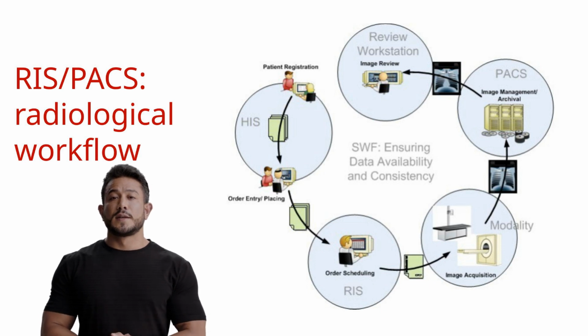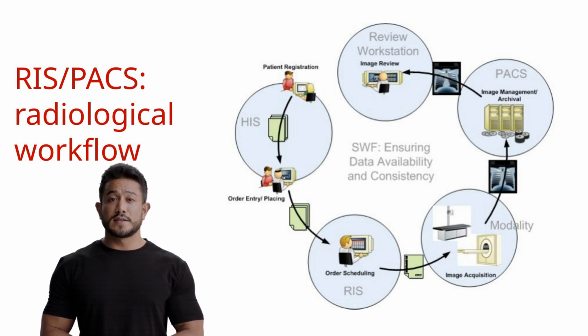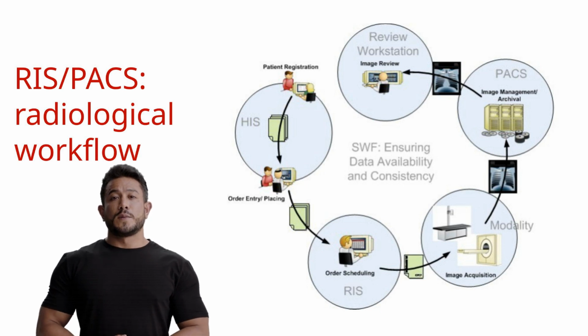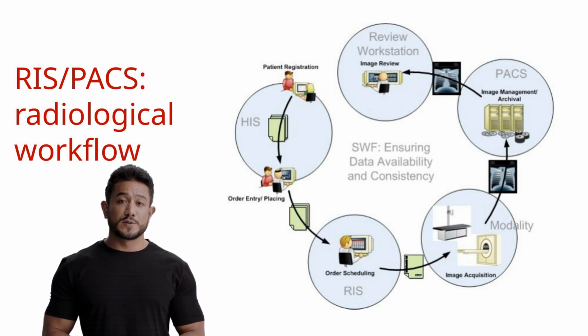On the specified date, the examination is performed utilizing the capabilities of an actor commonly referred to as diagnostics or modality, for example, a CT scanner. The results in terms of diagnostic images produced are then sent to an image archive, known as Image Manager or PACS, Picture Archiving and Communication System, a system for managing and storing images. At this stage, the radiologist will retrieve the diagnostic images based on the initial request and produce a report, which will be stored and delivered to the patient. The reporting process takes place on an actor commonly known as the review station.